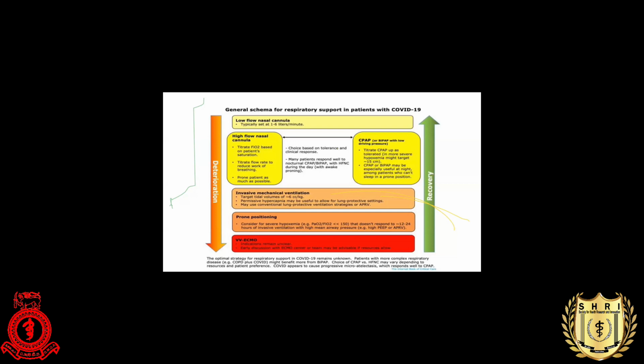I think they're asking about the effectiveness of an oxygen concentrator machine for providing oxygen in high flow therapy. Oxygen concentrators usually don't give high flow. They usually give 5 liters per minute, but some modern versions give about 10 liters per minute. So you can't use them for high flow oxygen therapy unless you convert them with some high flow device. No, you can't. Just an oxygen concentrator, no high flow.